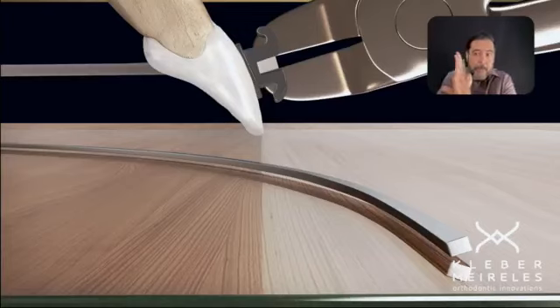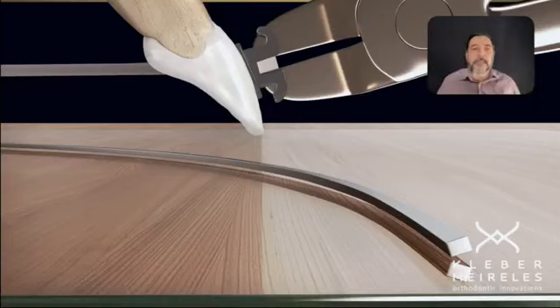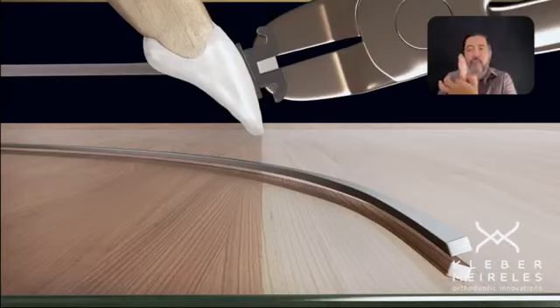I don't want the crown and the roots going distal or mesial in this condition. I want to keep the apex inside the symphysis and change the inclination towards the position that I want to compensate for that type of malocclusion.